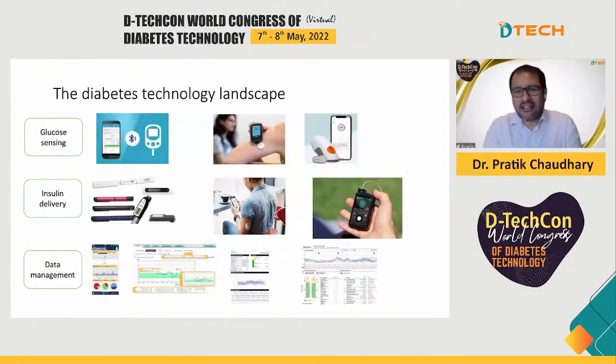And I think this is getting increasingly important because the diabetes technology landscape is transforming the way we measure glucose, whether that's connected glucose meters or increasing access to continuous glucose monitoring, and it is changing the way we deliver insulin. At the ATTD that Jyoti was saying we were at last week, we saw connected pens from all the major companies coming through.